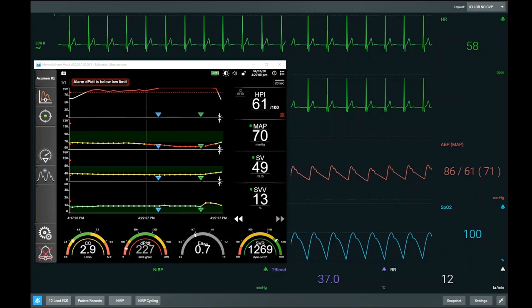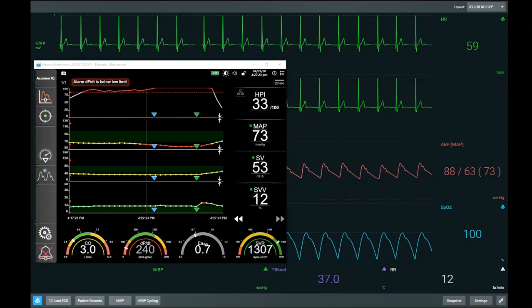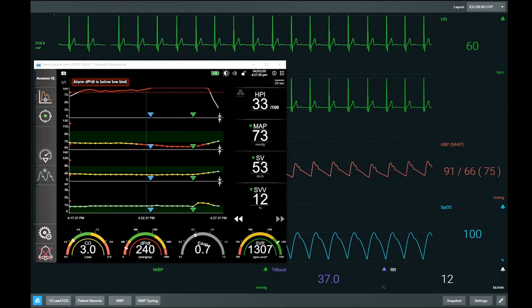And by using our secondary parameters, such as SVV, dP/dt, SVR and EA, we can investigate the underlying physiology that is causing hypotension. We can decide what is the incorrect treatment and also decide what is the correct treatment in order to rectify the underlying physiological state. And now as you come to the end of stimulation, we can see ephedrine has had its maximum effect. We've increased our blood pressure outside of the range where harm is associated.